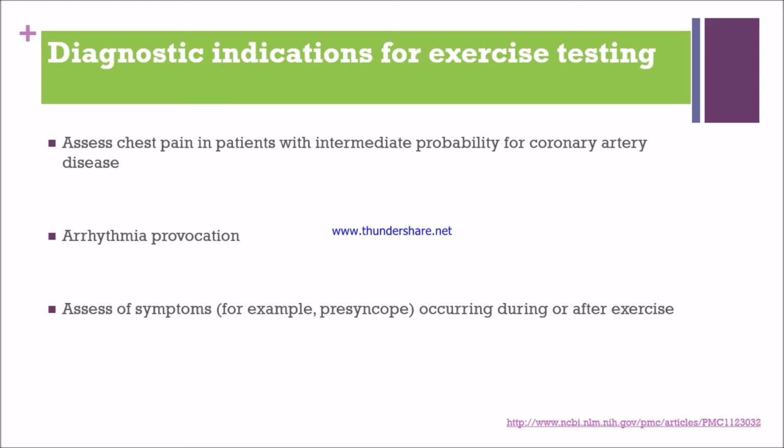If the patient is having pre-syncope, we need to see the symptoms during the exercise ECG testing. Symptoms like lightheadedness, muscle weakness, blurred vision, feeling faint. These are all the pre-syncope symptoms. So we need to monitor these symptoms during the exercise stress test. If these symptoms occur, we need to terminate the test and refer them to their physician.